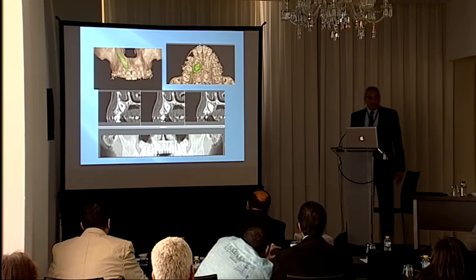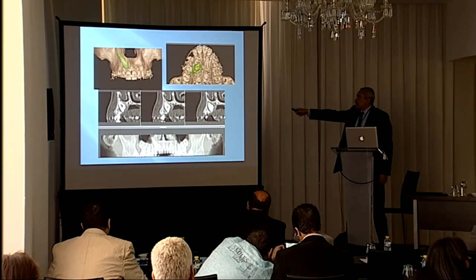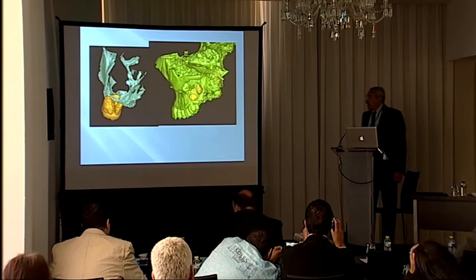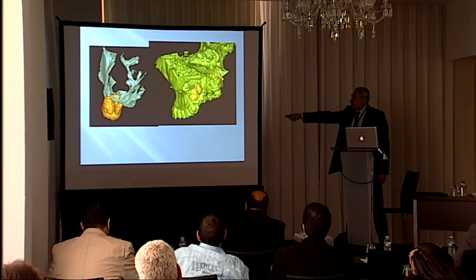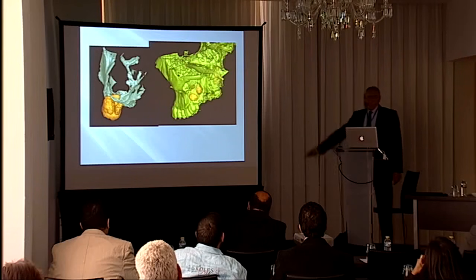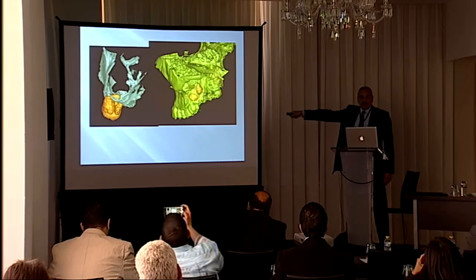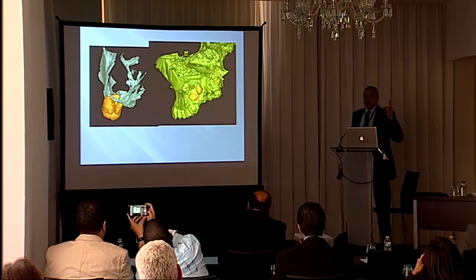In impacted teeth, it's much easier for everybody to see the impacted tooth, like a maxillary canine, in its full shape in 3 dimensions, and you can see exactly where the crown is and where the roots are and the relation to adjacent structures. You can see the roots of wisdom teeth that are really inside the maxillary sinus, and I can tell you that in this case, I couldn't see that distomolar impacted except when I did the 3D model, because it looked like one tooth impacted.